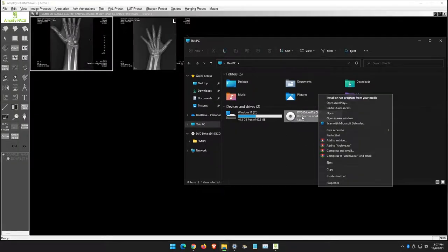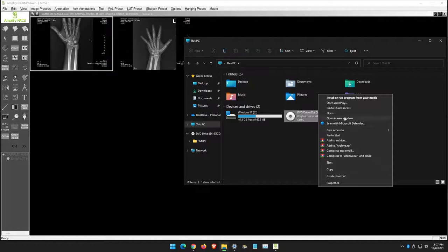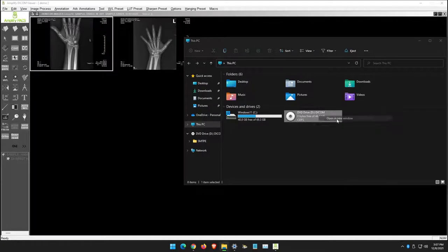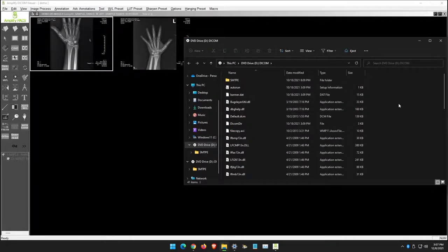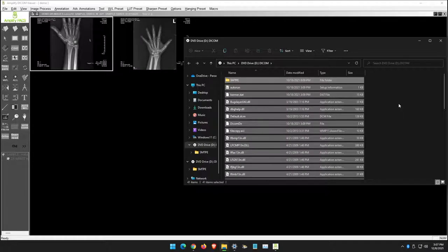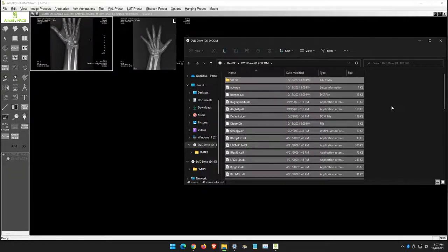I'm going to right click on it and click open in a new window. You can select all the images on the CD. I'm pressing CTRL-A to select everything, then CTRL-C to copy everything.